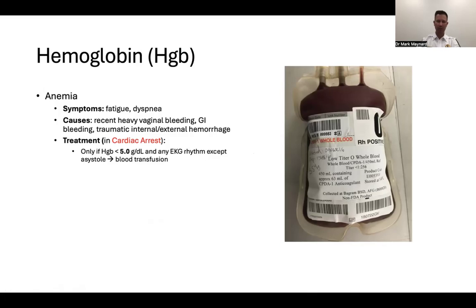Of course, if we don't have blood, we won't give blood, but sometimes we might be able to make sense of why a patient is feeling fatigued, especially a childbearing female with heavy vaginal bleeding. They're complaining of fatigue and shortness of breath. We might say, oh yeah, it's because your hemoglobin is very low.